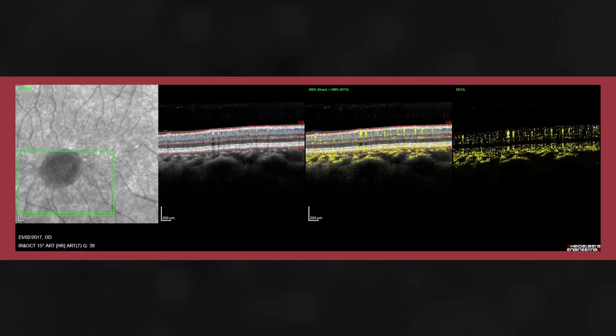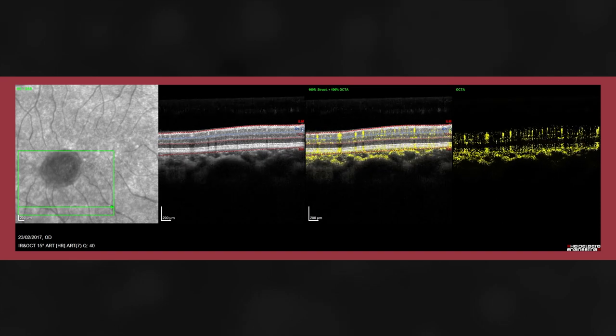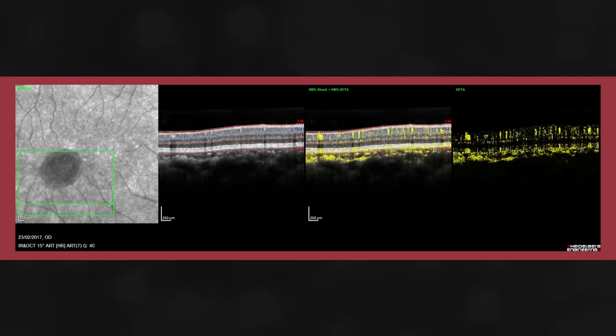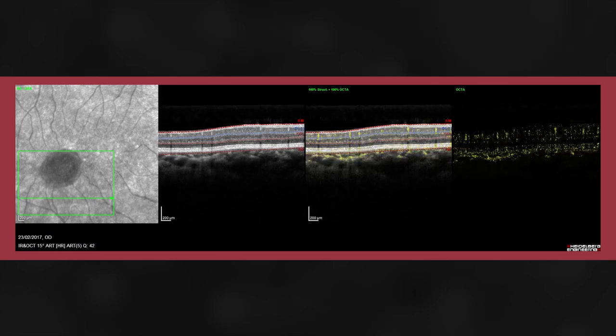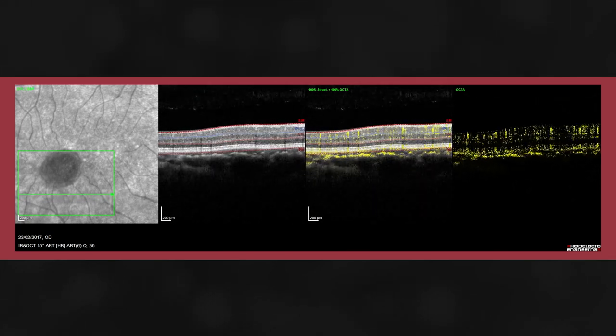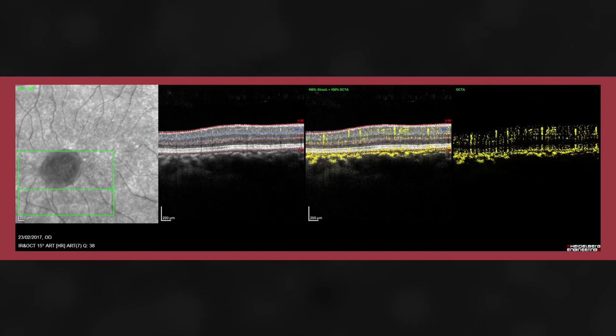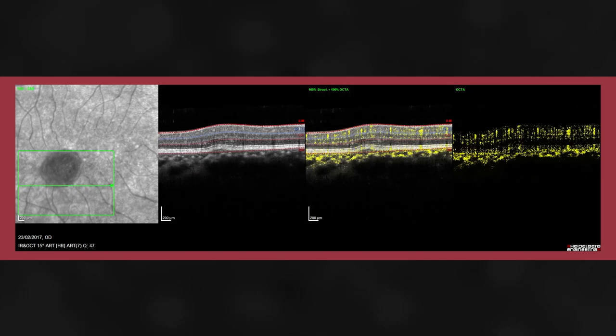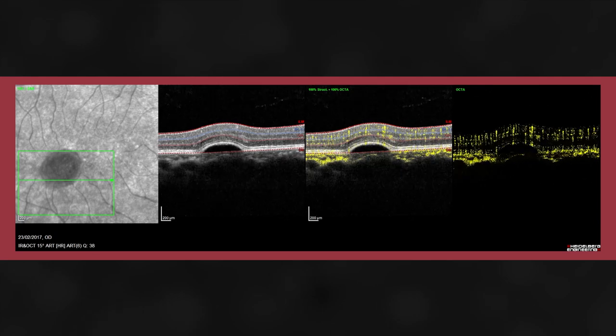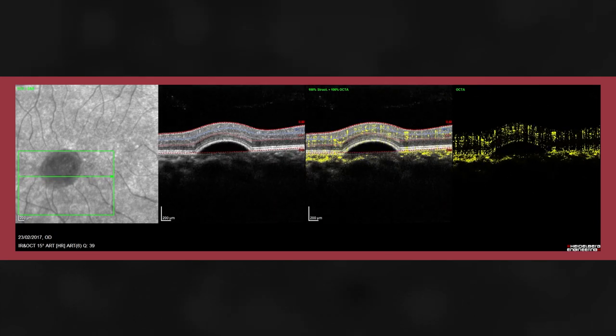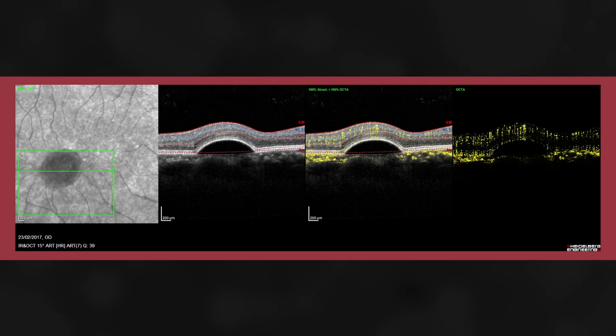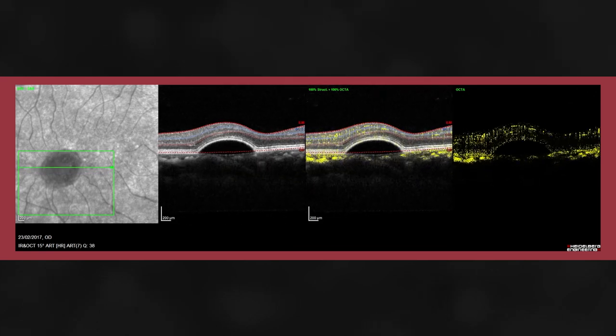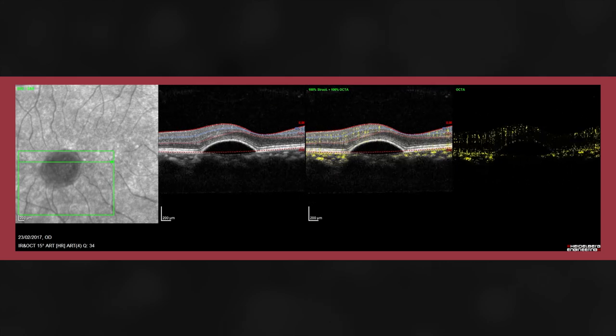In this example, we can see structural OCT plus flow. We try to identify non-physiological flow. Of course, we can see physiological flow within the choroid and retina. In this particular example, there is a serous PED. It would be important to try and identify whether this is driven by neovascularization. As we run through the images, we see no abnormal flow at the edges of the pigment epithelial detachment.